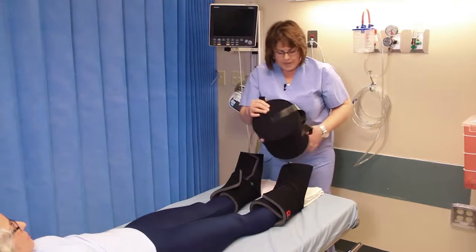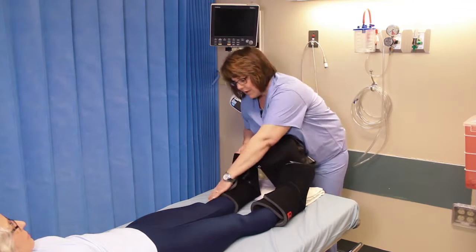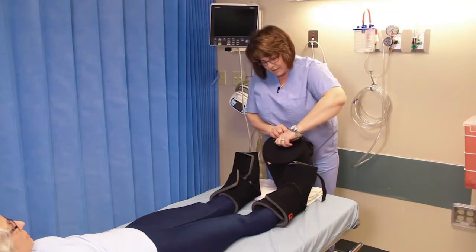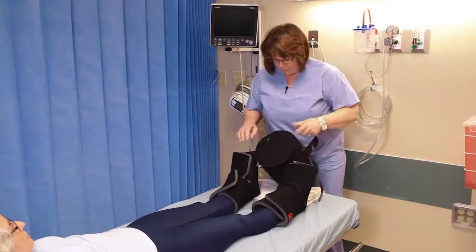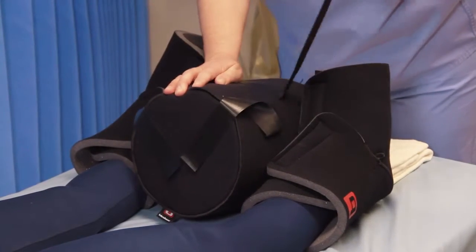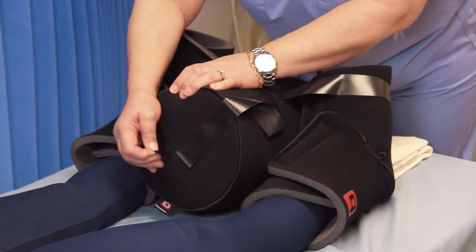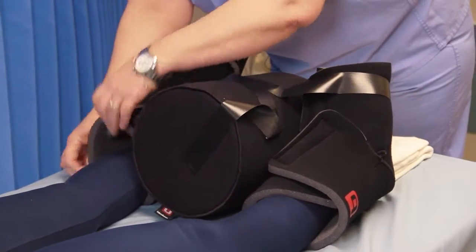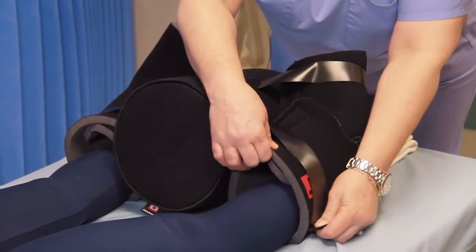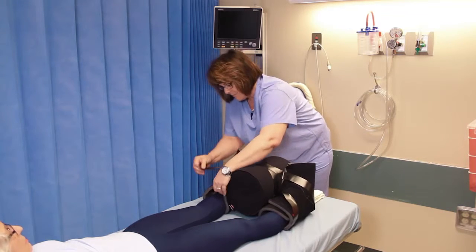You would then take the drum and put the Velcro from one side to the forefoot, calf to the forefoot, making a big X with the Velcro. Position it in between and start the process. Try to pull the feet in to make them pigeon-toed because you do not want the foot to fall out. Pull that right in, and pull that right in.